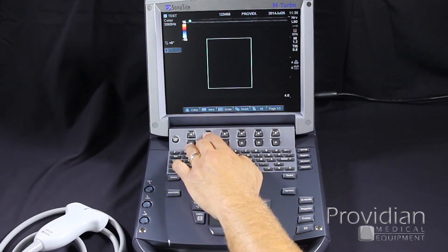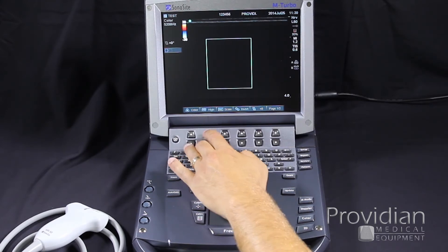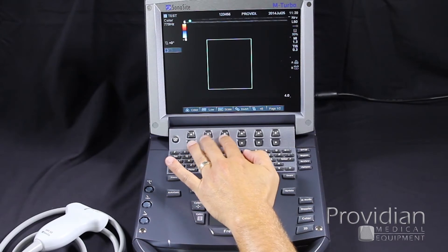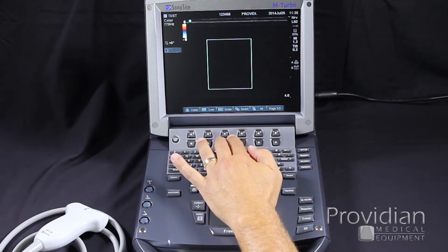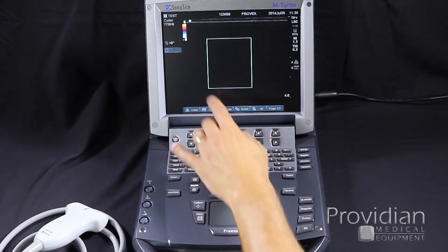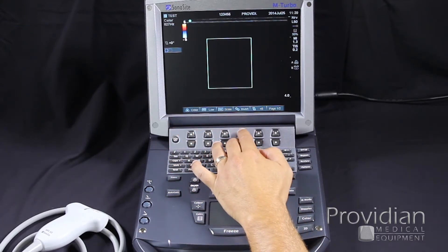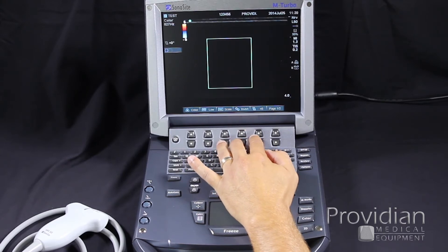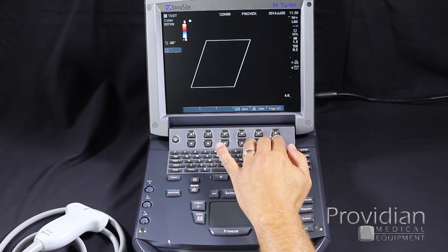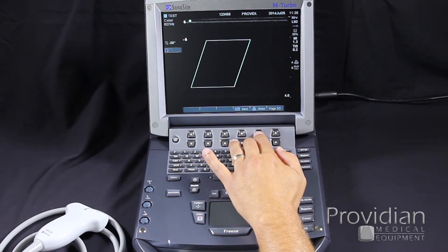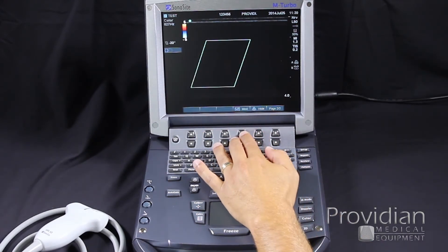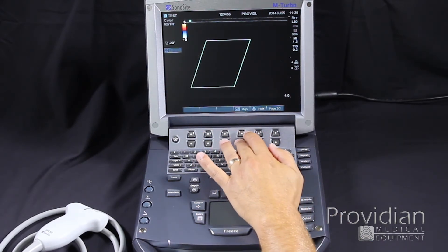Here we have our color flow. It's optimized for high flow, medium flow, and low flow, depending on the speed and velocity of the blood. PRF changes our pulse repetition frequency scale, as you'll see up above. Invert will flip that color map. This will steer your color box. On page 2, we can do color suppress mode where we can hide and show the color. And here we have our wall filter for general sensitivity.